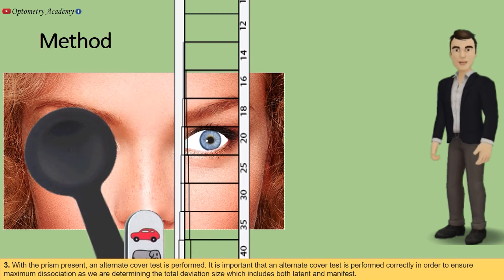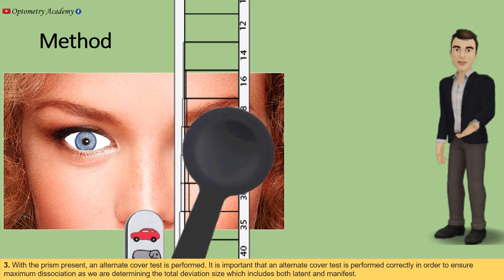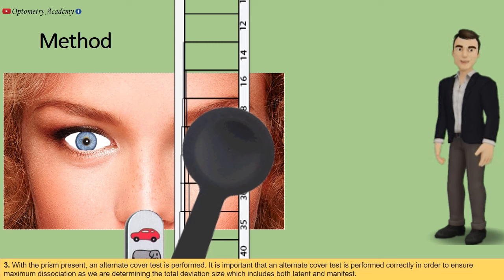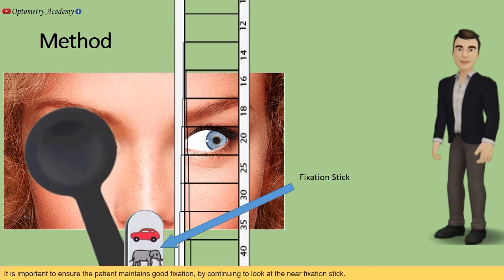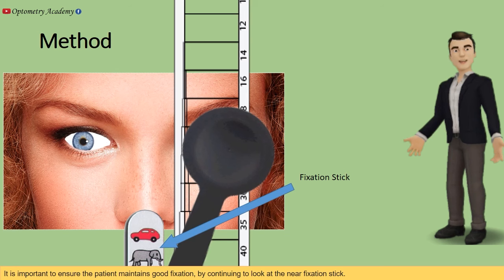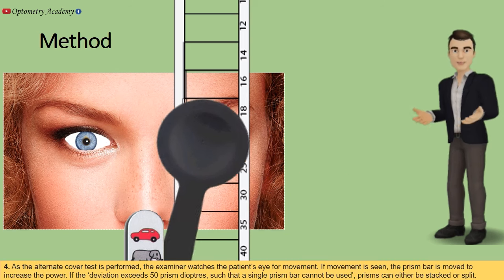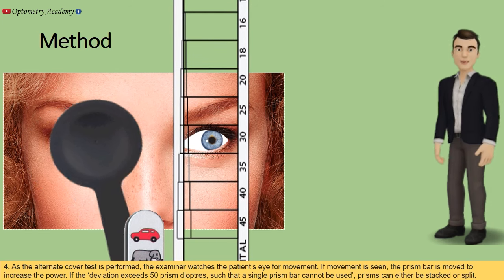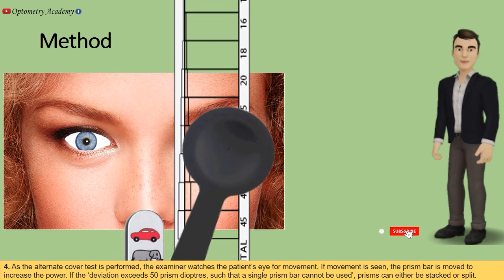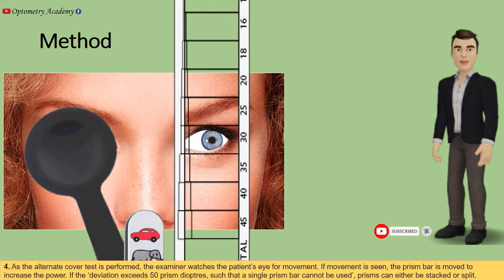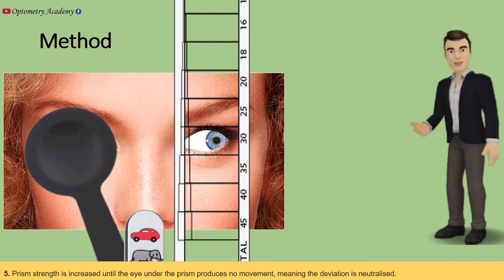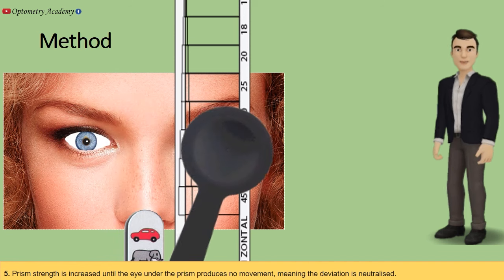It is important that the alternate cover test is performed correctly to ensure maximum dissociation, as we are determining the total deviation size which includes both latent and manifest components. It is important to ensure the patient maintains good fixation by continuing to look at the near fixation stick. As the alternate cover test is performed, the examiner watches the patient's eye for movement. If movement is seen, the prism bar is moved to increase the power. If the deviation exceeds 50 prism diopters such that a single prism bar cannot be used, prisms can either be stacked. Prism strength is increased until the eye under the prism produces no movement, meaning the deviation is neutralized.